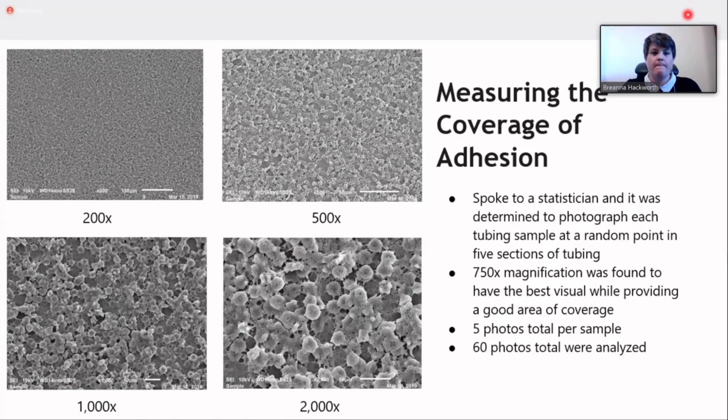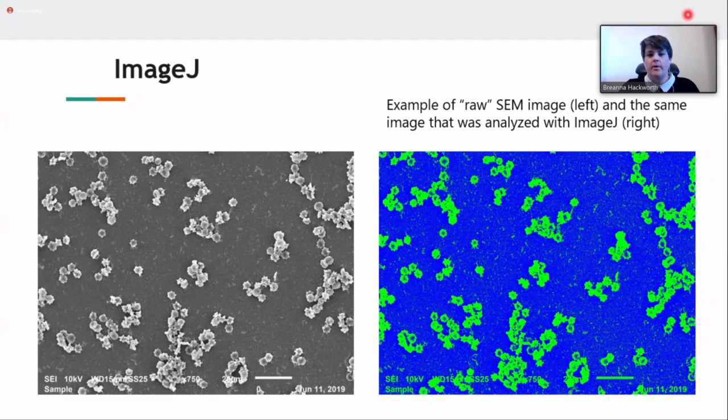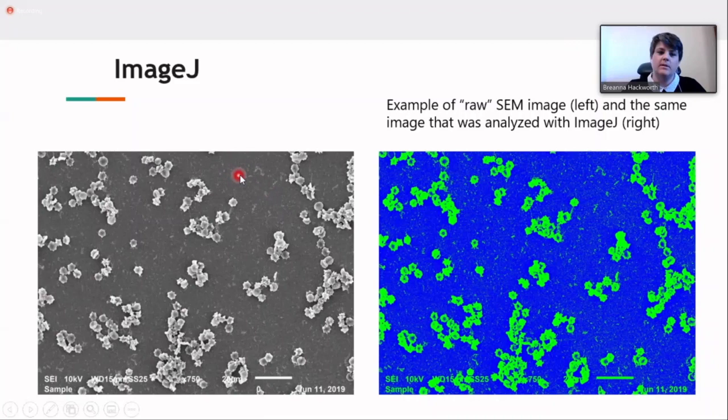How did we analyze this data? We used an image software called ImageJ. It was recommended by Dr. Mitchell, who uses this software quite a bit. How ImageJ works—it uses color differentials in order to show a base, and then also anything that's on top of that base. You could see the dark here on the left-hand side would be the base of the tubing, and any of the white are the adhesions that you would see. On the right-hand side, this image is the image that had been run through ImageJ, and it'll give you a percentage of that adhesion.